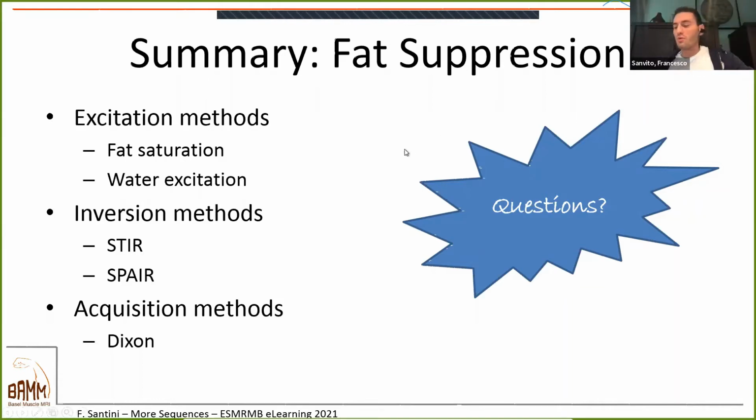I have one quick question about the inversion time that was brought up before. So in STIR sequences, right, would that depend on B0? Meaning, is it different at 1.5 Tesla compared to 3 Tesla? Yes, it's different. I don't remember exactly the values, but you have tables. No, of course. Just Google it.